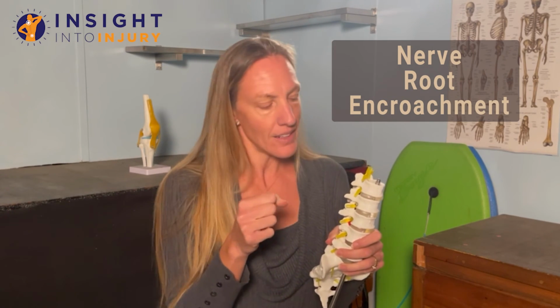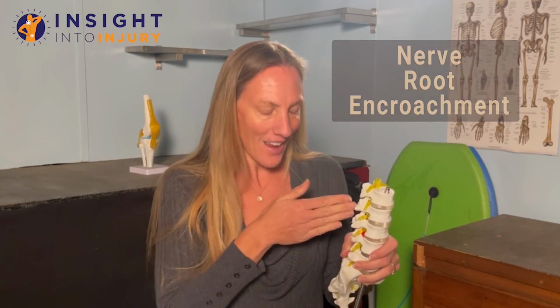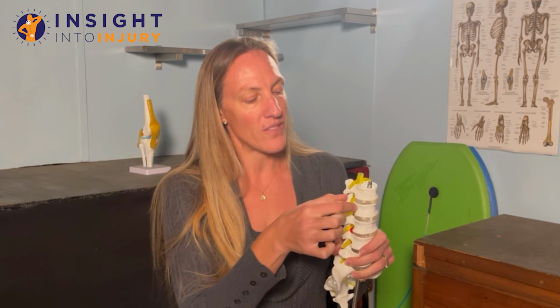Nerve root encroachment. Encroachment is like getting pinched off or squeezed down, and the nerve root here happens right where the nerve exits the spinal cord area, and if that's getting pinched, you'll be feeling those symptoms throughout your body too. So that's just a few quick things as to how to interpret your MRI reports.